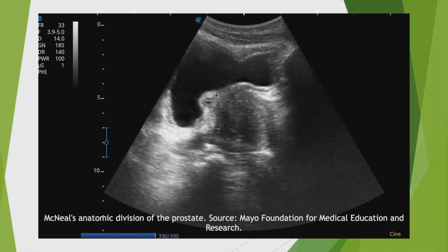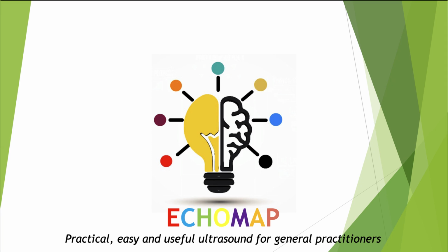So here you see an increase in the transitional zone, which is clearly visible, which is the most visible part of our patient's prostate in the context of a prostatic adenoma.